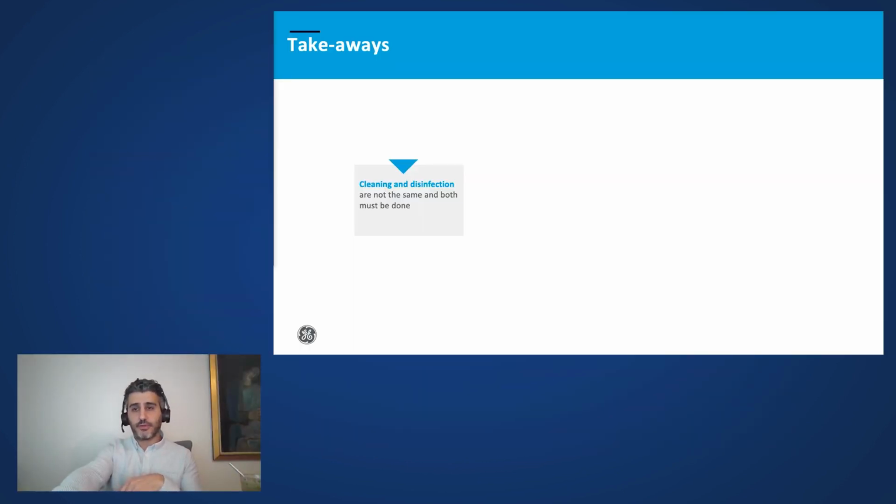I have 4 takeaways for the audience. The first one is knowing the difference between cleaning and disinfection, knowing the importance of performing a well done cleaning of the probe and then doing the disinfection, and that it must be done between each examination. So again, it's not acceptable to only wipe off the gel and think everything is fine. So we need to do cleaning in a proper way and then the disinfection in a proper way.